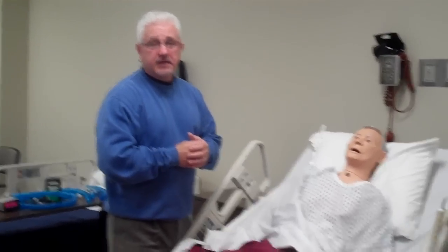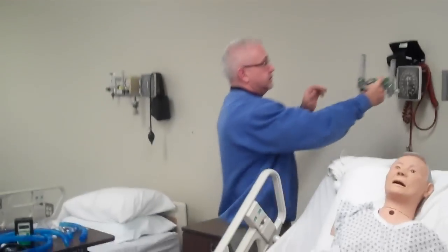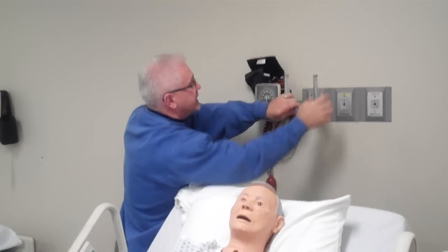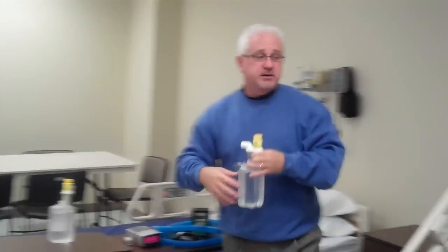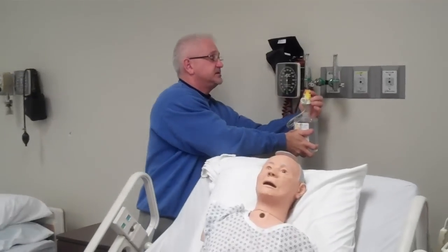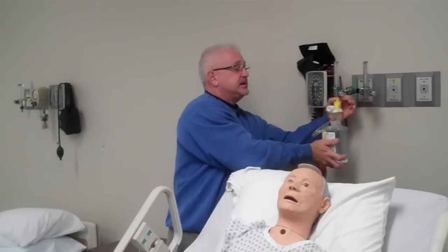I'm looking for a response from the patient to confirm they understand. If there was a family member in the room, I would confirm with the patient that it was okay for them to stay, and make sure the family understood what I was saying and ask if they had any questions. If nobody had questions, at this point I would go ahead and set up the equipment. You can set up the equipment, but you cannot put it on the patient until you've done your patient assessment, which consists of checking the patient's heart rate, respiratory rate, sat, color, and level of dyspnea — I need that pre-information before placing the patient on oxygen.